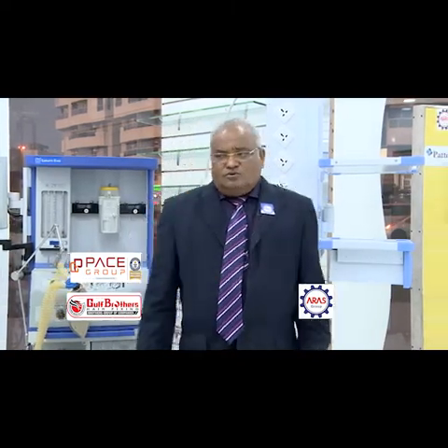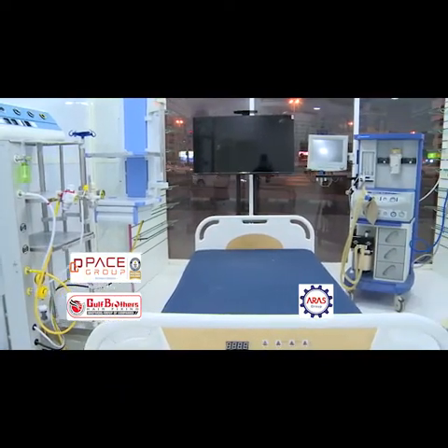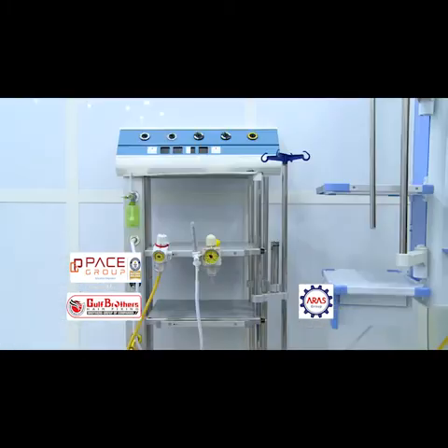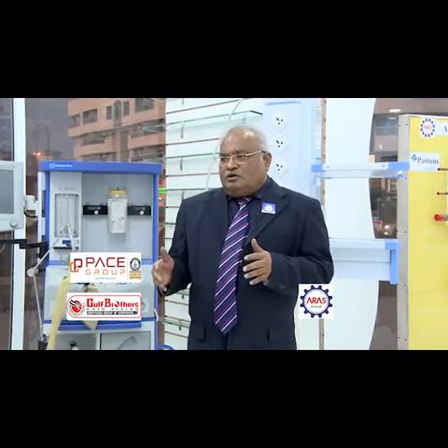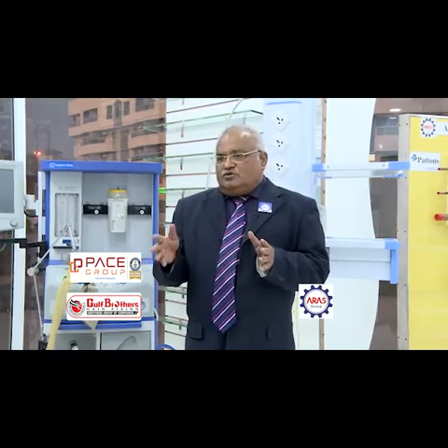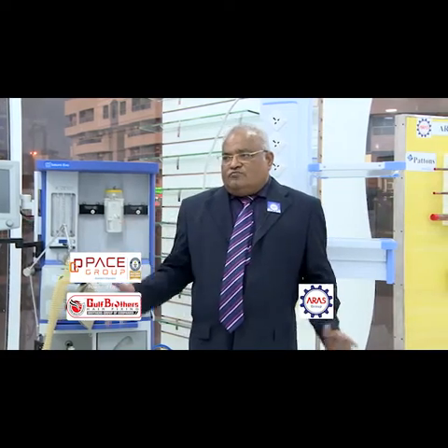After the operation theatre, a similar setup is used for the recovery. Recovery also needs all the gases, but the majority of the gas is oxygen, air and vacuum. After the operation is finished, we go to the recovery. Then after the recovery, the patient goes to the ward area. This way the system goes on. We are providing all the facilities.